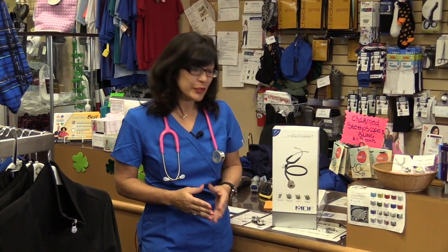Come check out the stethoscope. They are only $88, and you can combine this into like three different stethoscopes in one. It comes in a large variety of colors.